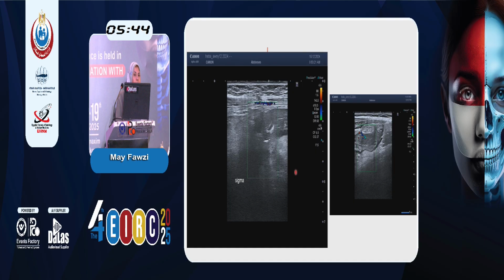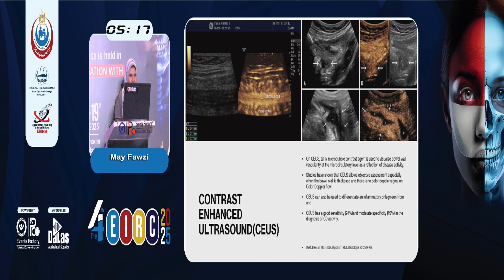As you can see, this is a markedly inflamed bowel loop, and there's very poor stratification. There's a suggestion of here, a tract right there. This is not bowel, this is a fistula. And there is leaking from the bowel wall into the surrounding fat. The surrounding fat is trying to collect and hold on to the inflamed loop. Okay? Very characteristic, in need of therapy.